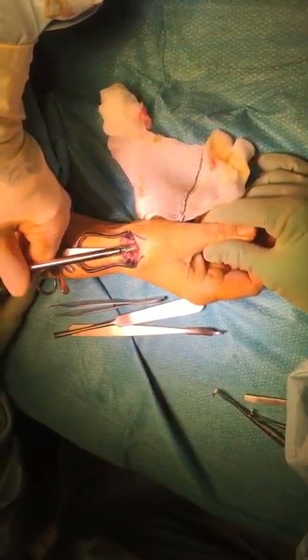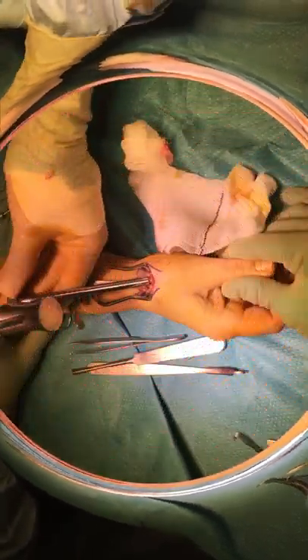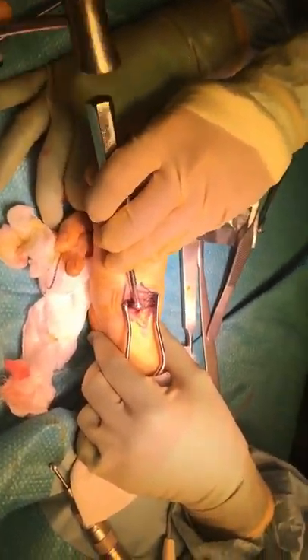Attention is then centered on the metacarpal, and the metacarpal is reamed and rasped to the appropriate size.